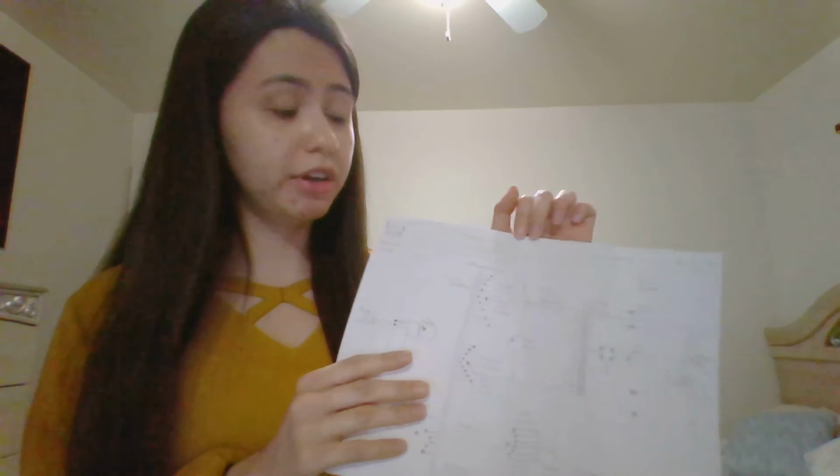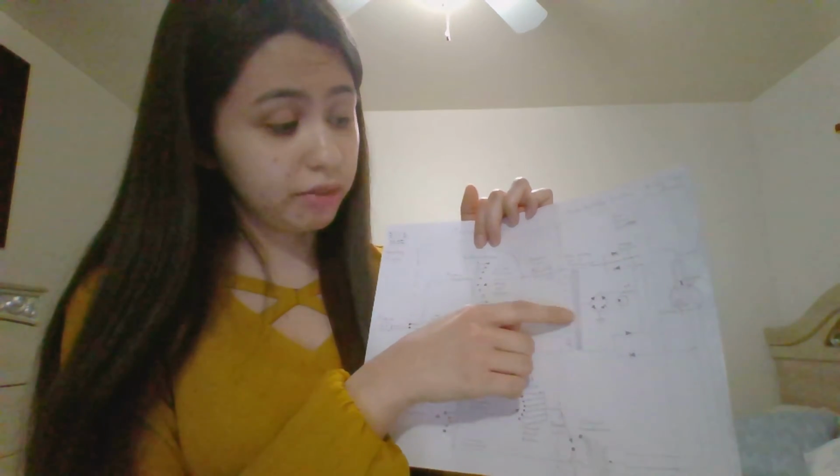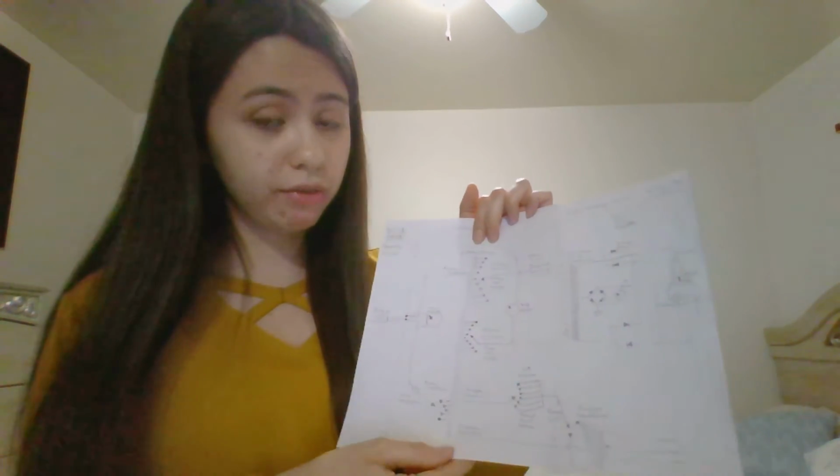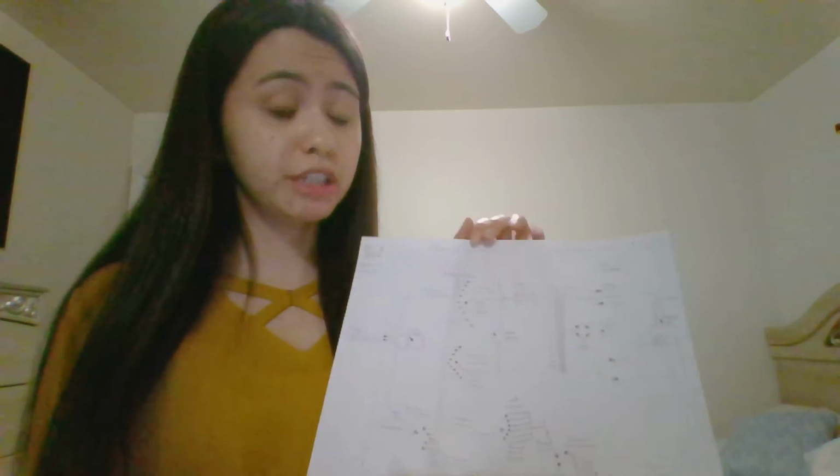And there is also a kVp meter, and the kVp meter is just going to estimate what the kVp will be at the very end of this whole circuitry. So next, the voltage is going to go through the high voltage step-up transformer. And this is also going to increase the voltage according to the turns ratio. And at this point, once we increase it, it's going to be an alternating current.